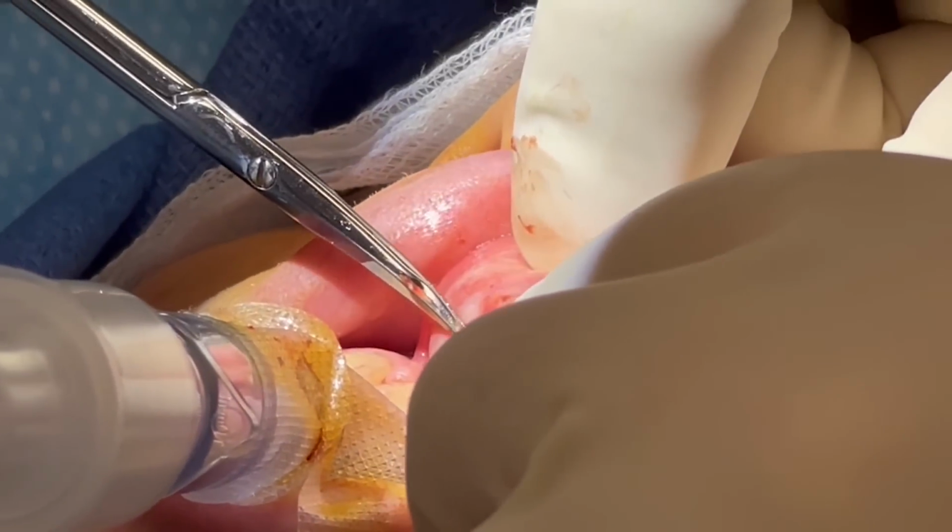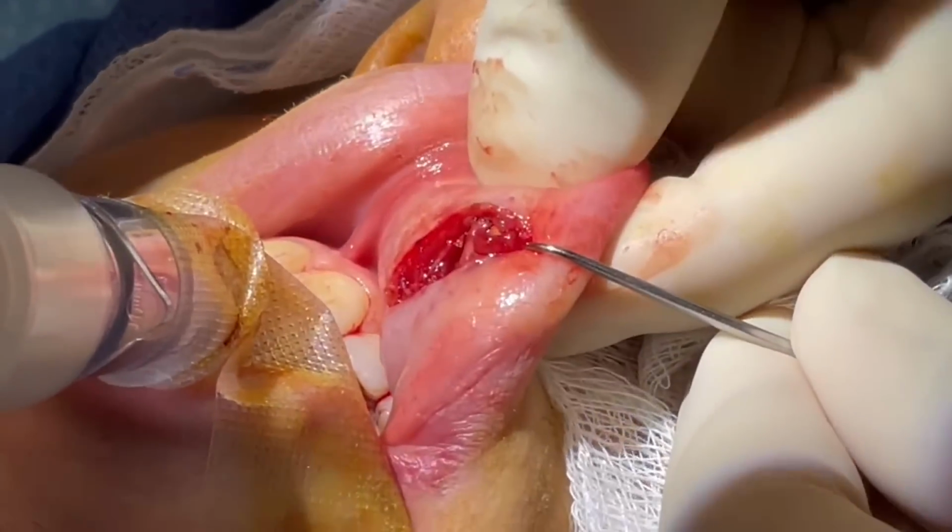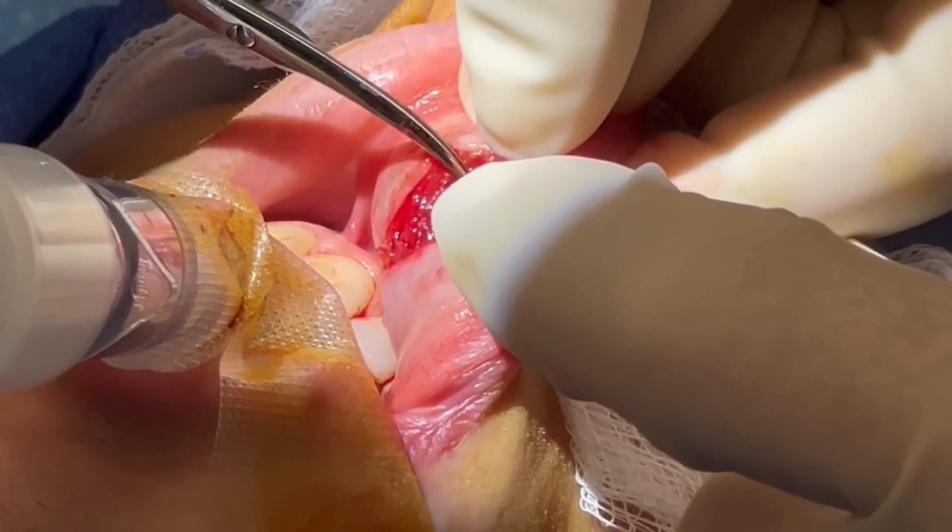It's that right there. That right there. You see? Right, yeah. Where's that?